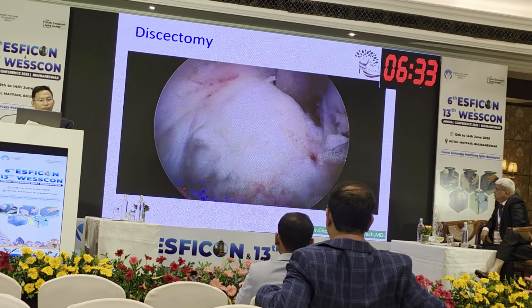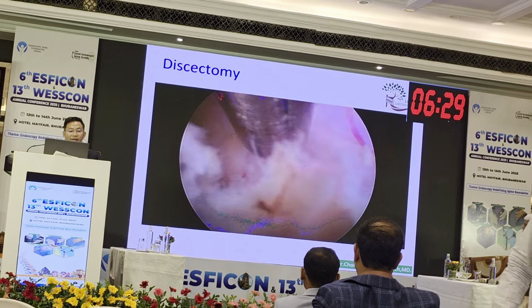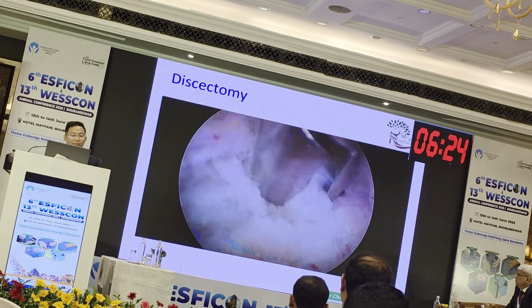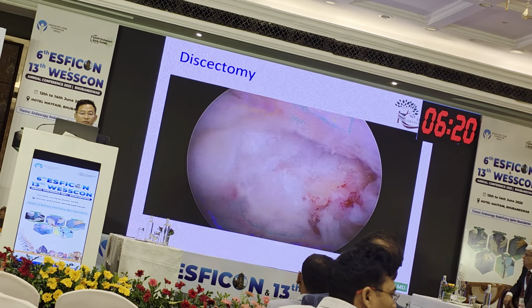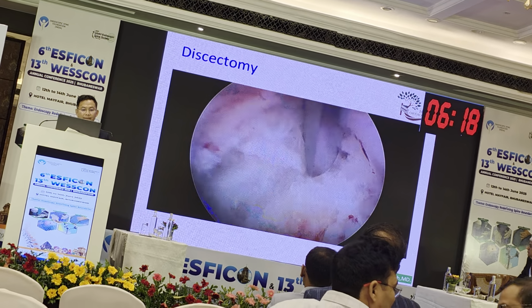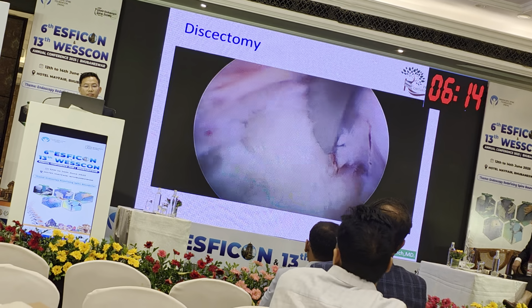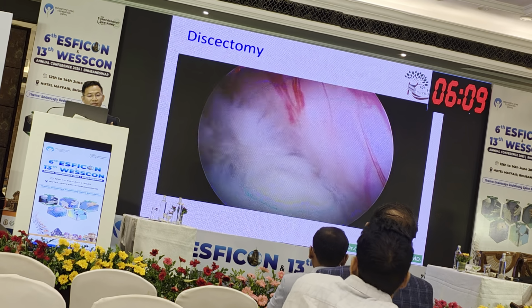I recommend you don't distract the medial side of the cord because of possible injury, and we have to use neuromonitoring to monitor all the time. You can see this is lateral more central. If it is a central disc, maybe it cannot be removed.